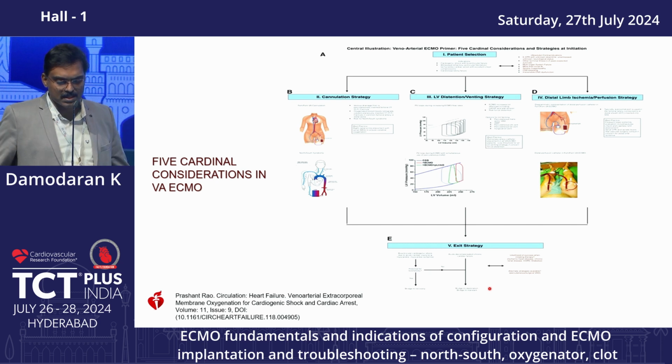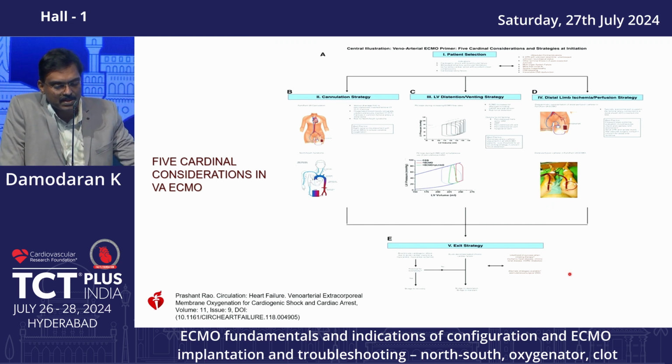select. Suppose a patient is in hemometabolic shock or recurrent arrest, those are not the patients to put on ECMO. So you need to first define whether this patient has a recoverable or treatable condition. Need not recover. Treatable means we can bridge them to VAD or transplant. This is a basic point you have to understand before putting the patient on ECMO.